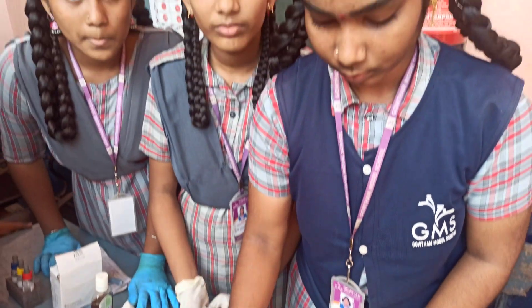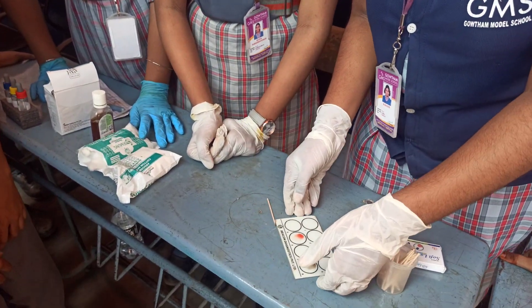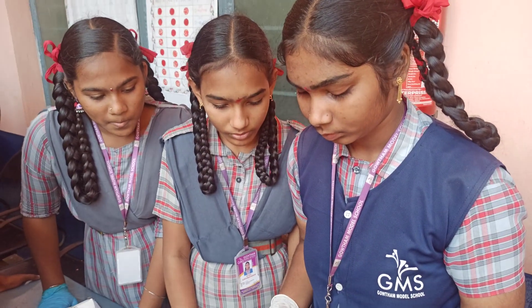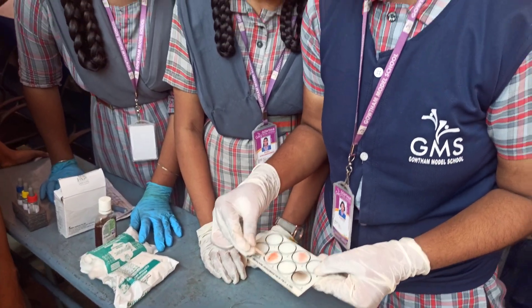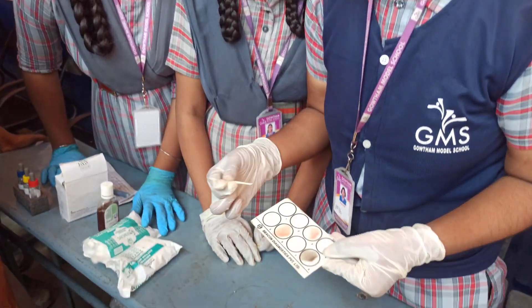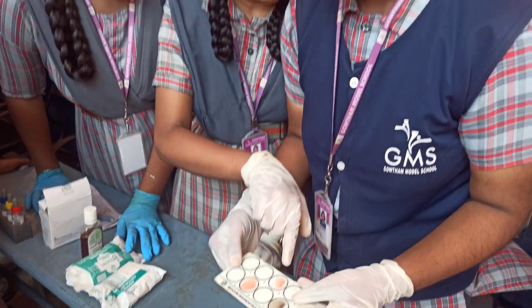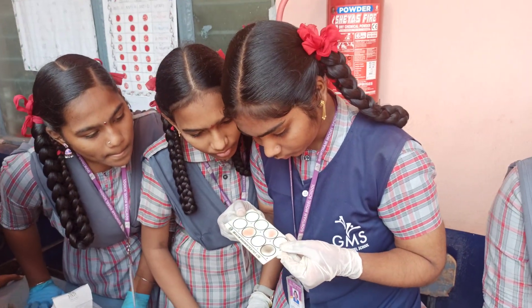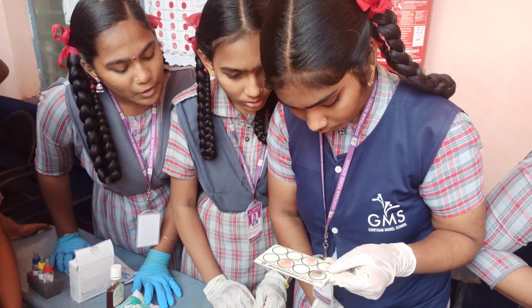My name is Sachinaran Razu. I am testing my blood to check my blood group. Come to Matthew's please, let's try it as a teacher.